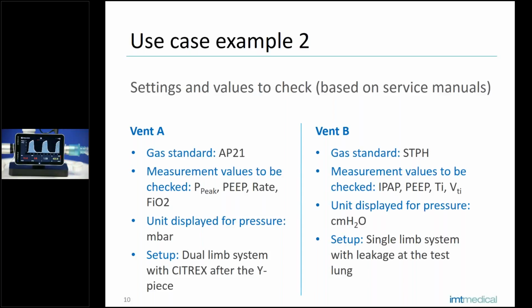I need different trigger settings here which match. Let's say I know them. So I'll just go to my settings screen here, trigger details, and start condition here. I know that it works best with the pressure signal on rising edge of 5 millibar. A start condition, stop condition, I will also choose pressure here, and falling edge at 10 millibar, that's okay. So these are the trigger settings I know that work best for my ventilator B.